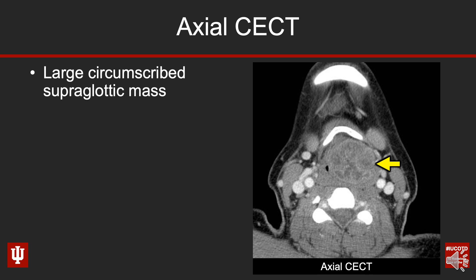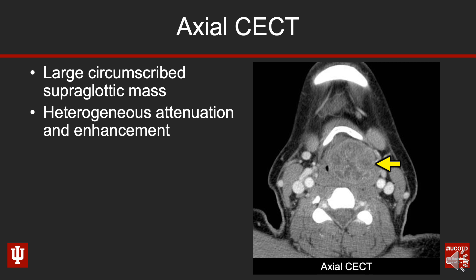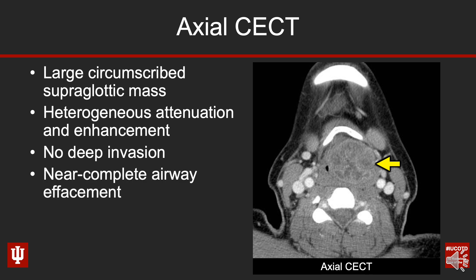First up, we have an axial contrast-enhanced CT at the level just below the hyoid bone. Where the yellow arrow is pointing, we have a very large supraglottic laryngeal mass. If you take a closer look, this mass is actually quite circumscribed — you could take a pin and trace around the margins. The attenuation is a bit heterogeneous: some areas are a little dense, some a bit lower density, generally in the range of skeletal muscle, with some internal areas of lower density.